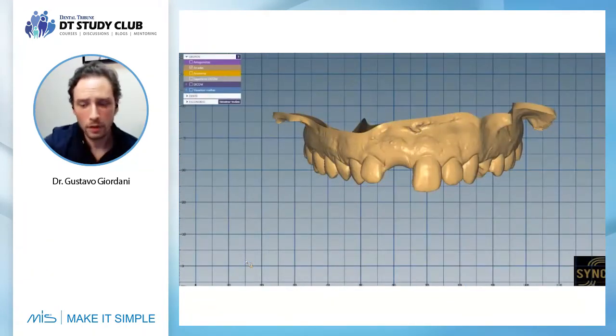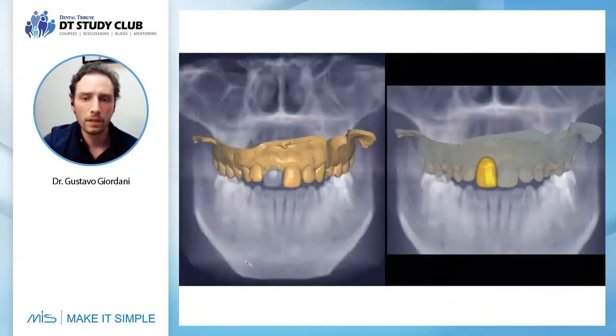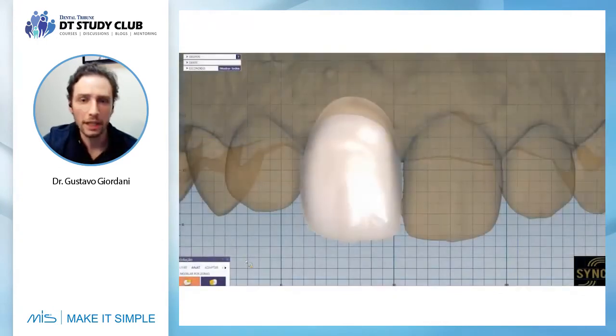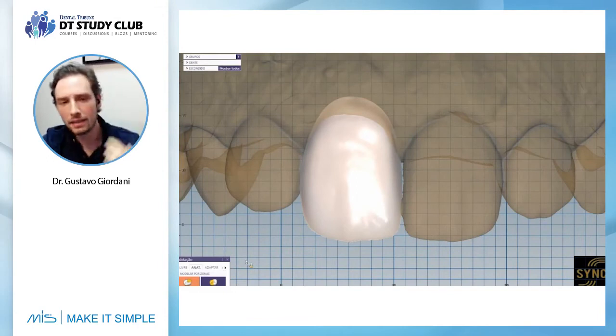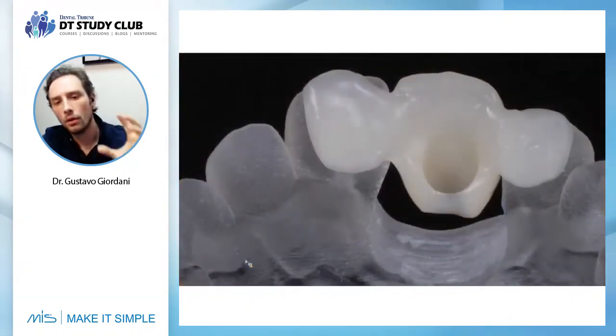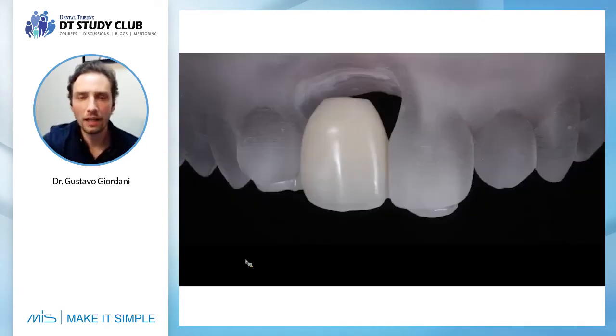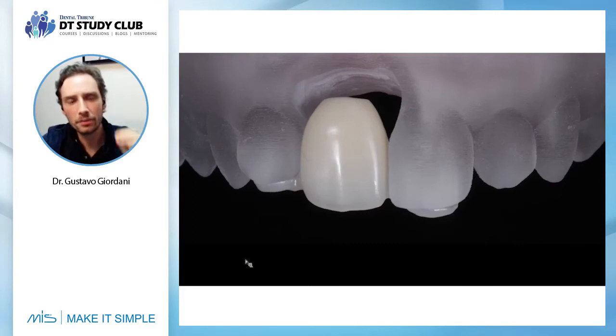They will remove the tooth inside the model, and then they will copy the tooth and copy the first millimeter of the root. By doing this, all the work will be done, and you're gonna get this provisional from your lab with a very good critical contour. And very important tip, ask your lab to do those wings so you can know exactly the perfect position to capture your provisional cylinder inside the mouth.